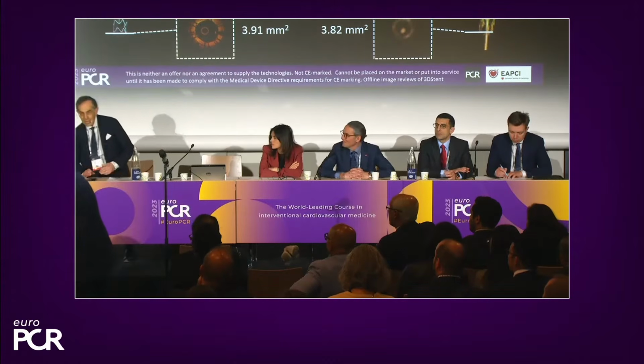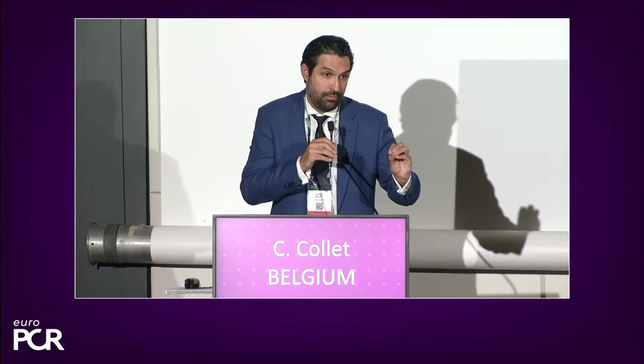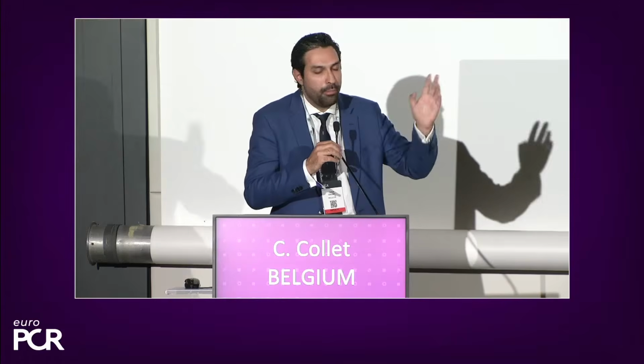That's a very good question. And you know, when we saw this technology from GE, we said, okay, it's good for expansion, but it's going to be even better for calcium. So calcium is one of the big potentials of this technology because it will allow you to assess circumferentiality, arc, etc. Concerning the other composition of the tissue of the vessel, this technology is not able to distinguish any sort of lipidic or fibrotic plaque, nor the vessel wall.